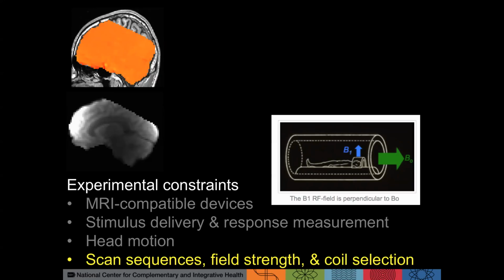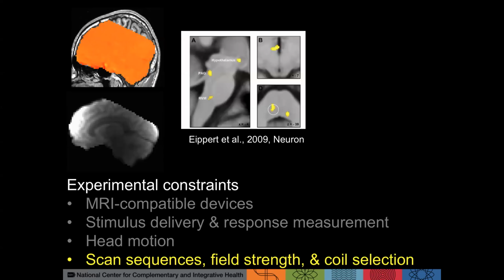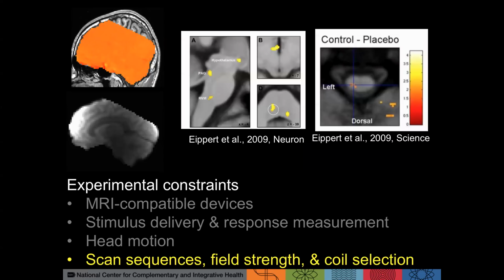Now this also becomes even more intriguing as you move to trying to get inferences on things like midbrain structures or even brainstem imaging. And brainstem imaging requires not only special sequences, but also special head coils, head and neck coil, and special sequences. So we can't always use fMRI to get inferences on every brain region. We have to think before we even start the study about what regions we care about.